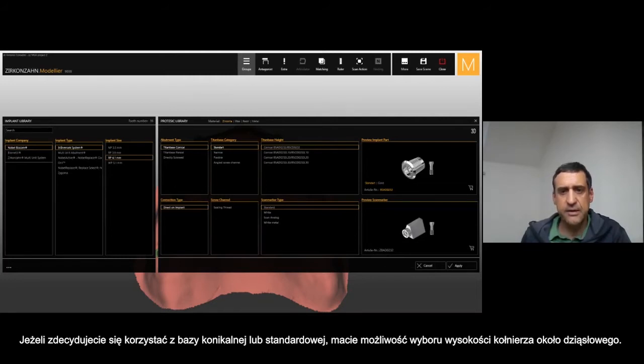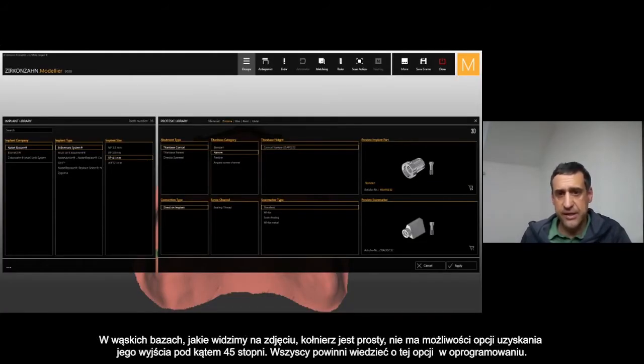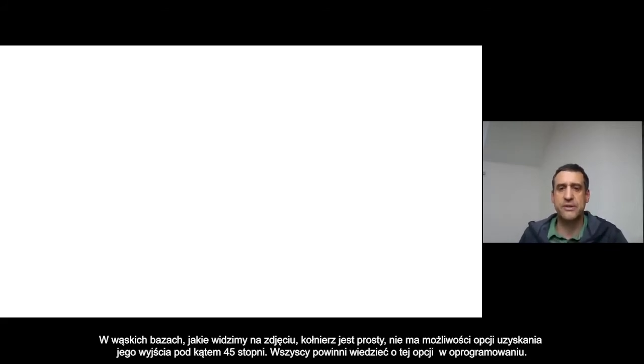If you choose the conical standard, you have different heights of the shoulder of the regular T-base. Then the narrow T-base — you can see from this picture the shoulder is not coming out at 45 degrees, but it goes really straight directly on the connection of the implant. That's something not everybody knows we have as an option in the library.